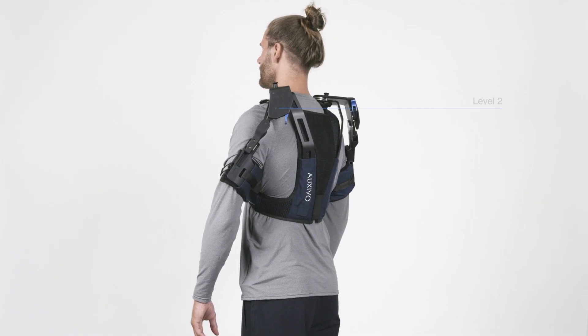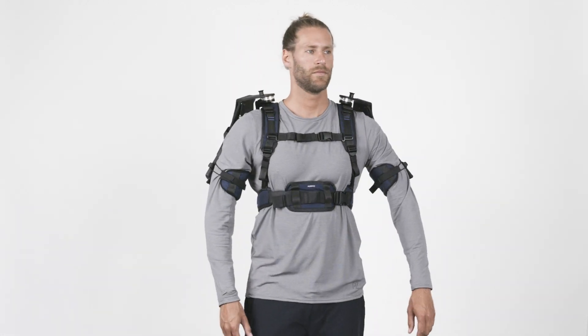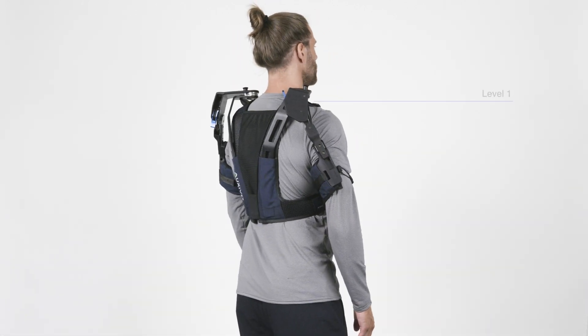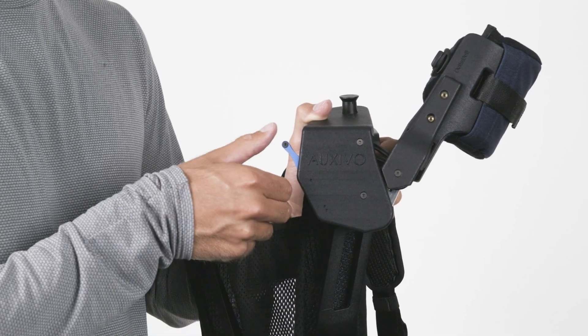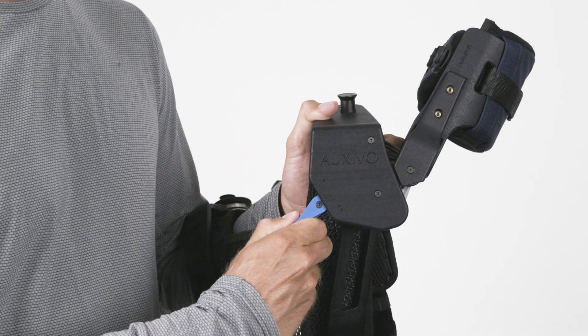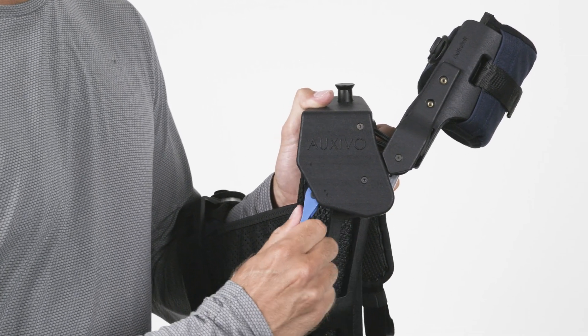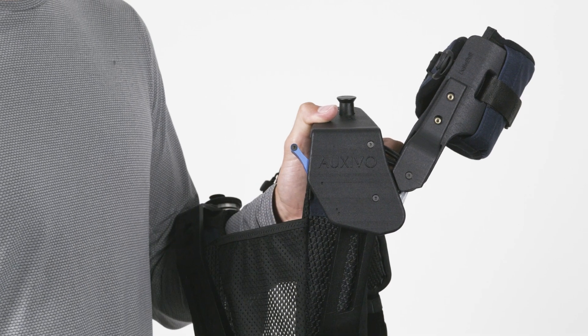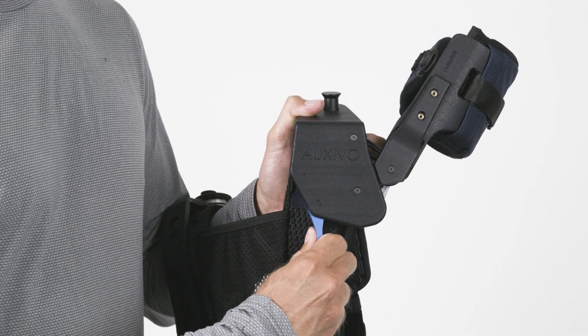The DeltaSuit offers two levels of support, with Level 2 providing around 30% more support than Level 1. You can switch between the two levels with the lever at the shoulder. Make sure to move the lever in a slow and controlled manner. Note that the lever pointing upwards is the lower support Level 1, and the lever pointing downwards is the higher support Level 2.